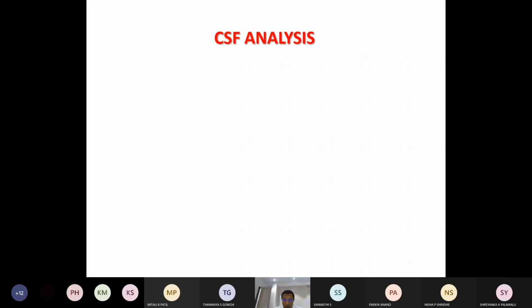So we'll see what the important parameters and normal constraints of the CSF are, the abnormal conditions, what happens to the CSF, and even important biochemical estimations of protein and glucose. Even chloride can also be done in the CSF biochemical analysis. There will be other parameters also, hematological parameters and microbiological assays, done for evaluation or diagnosis of the appropriate problems.